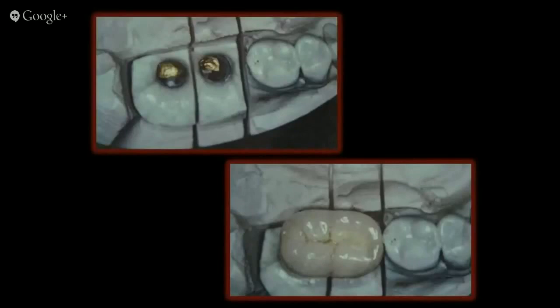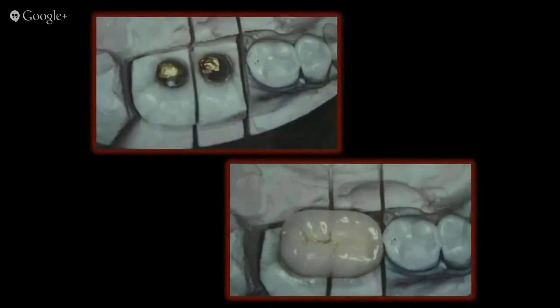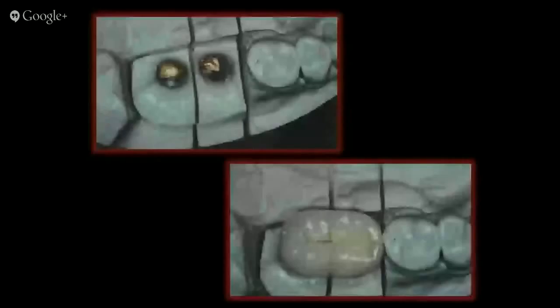So what is the angle I am introducing? What am I talking about? I'm talking about non-axial loading. I'm talking about shear stress, the tensile stress. Every time the patient bites, he is going to induce a lot of stress on the underlying implant. My bone is cancellous in the maxilla. Anyways, it does have a morphology of being somewhat weaker than the underlying cortical bone in the mandible. And I'm inducing, in fact, over-inducing the stress.